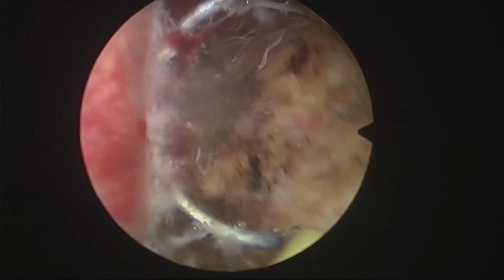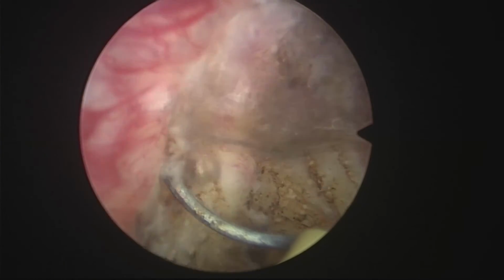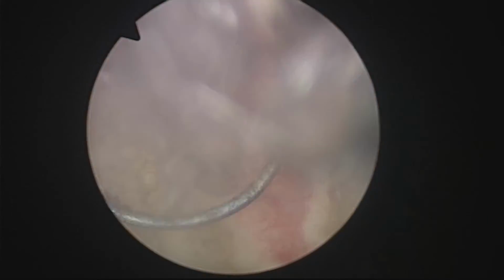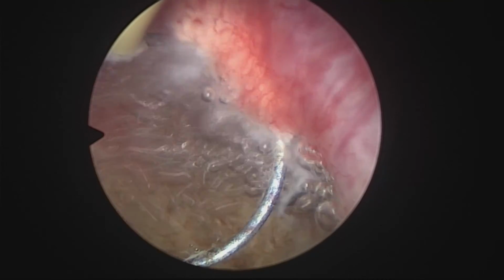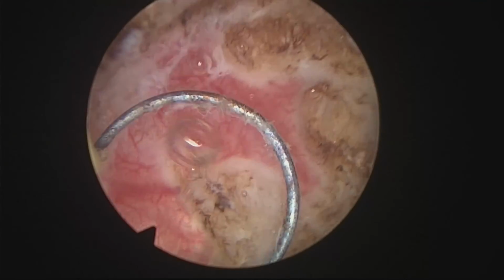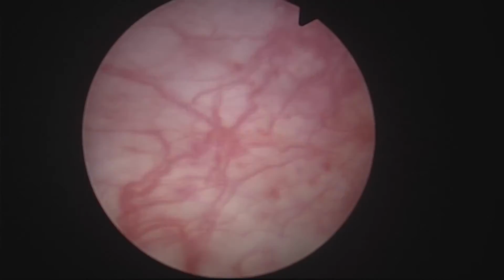and the idea is that if you coagulate the whole diverticulum like that, and you keep a catheter for 3 or 4 days connected to a bag, so the bladder is empty, this sticky surface is going to remain collapsed, and possibly it will connect again. This perivesical tissue will connect again with the bladder wall, and when reepithelialization takes place again, the size of the diverticulum will be less than the original. This is the endoscopic treatment of bladder diverticulums.